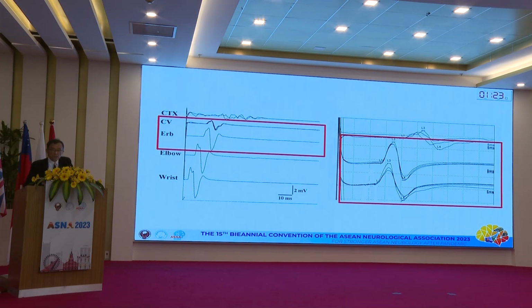So in addition to other conduction studies, please remember spinal TMS may detect some of the most proximal region of the motor nerve.